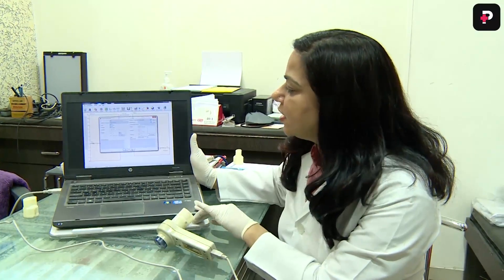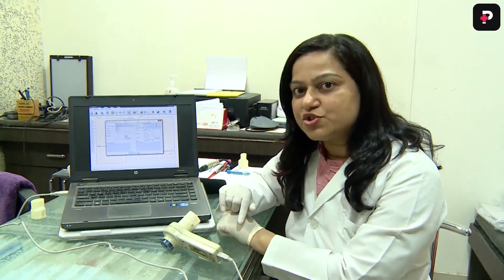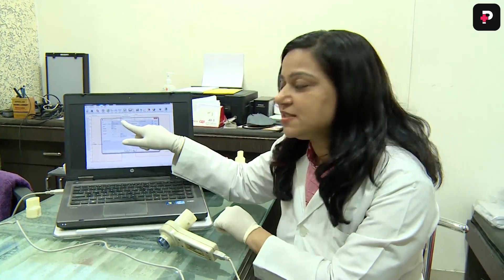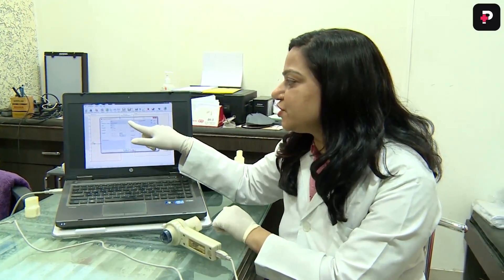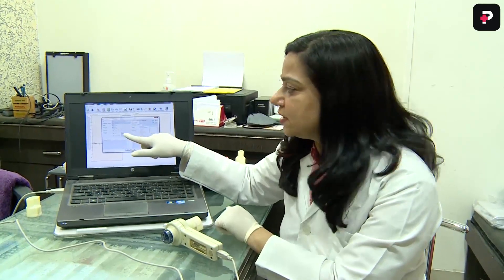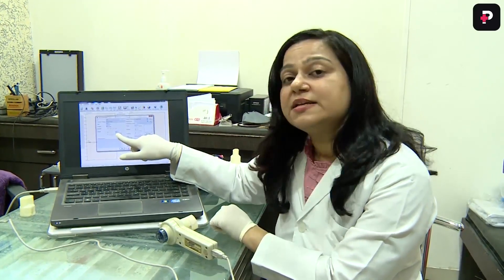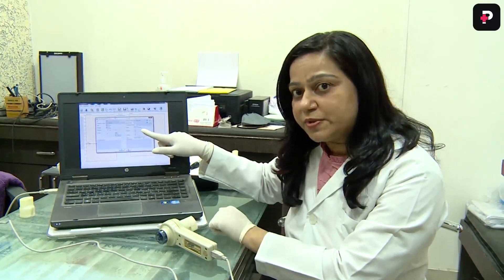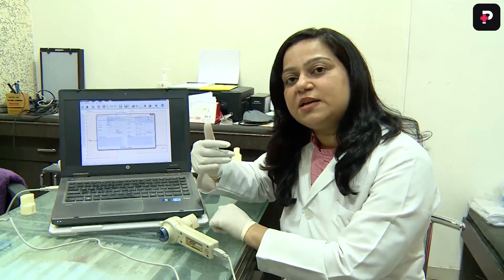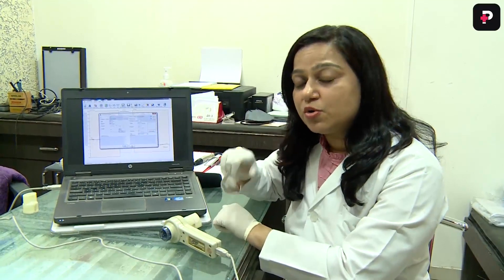When we start doing computerized spirometry, first is an information form in which we need to fill certain data of the patient like registration ID, patient name, age, weight, gender, and height in centimeters. It is done at room temperature and the position of the patient should be mentioned — whether it is sitting or supine position — and whether the person is a smoker or non-smoker.